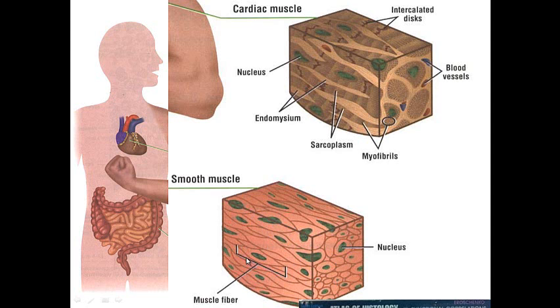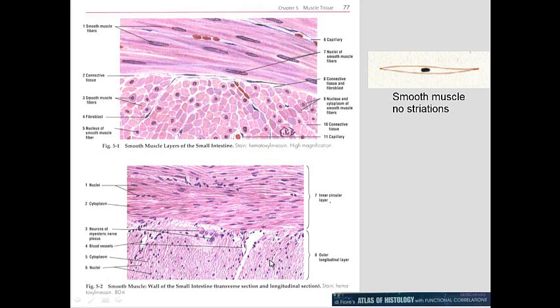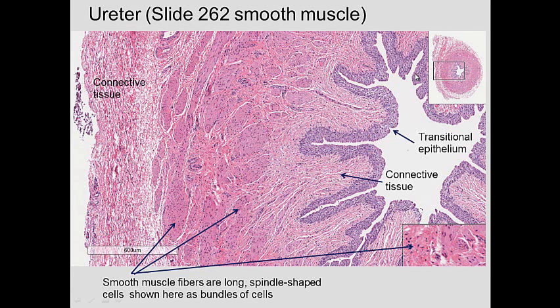So this is a muscle fiber or muscle cell. And if we look at that, we can see individual muscle cells. There's a nucleus of one, there's a nucleus for another one, and you can see the pink cytoplasm. Here we can see cross-sections of them, the nucleus in the center, but you can see the individual muscle cells there, and it is non-striated, as you see there.